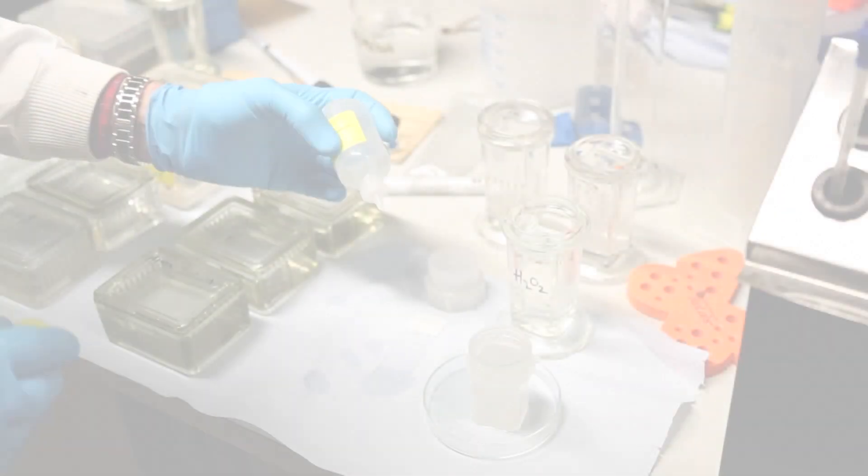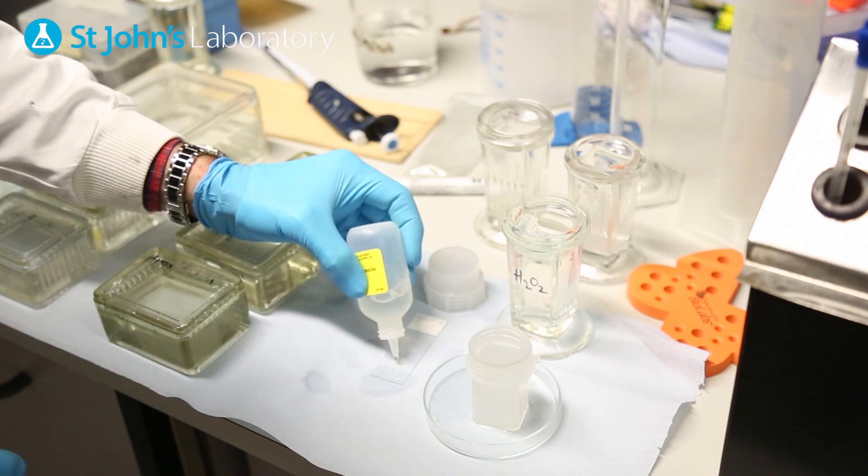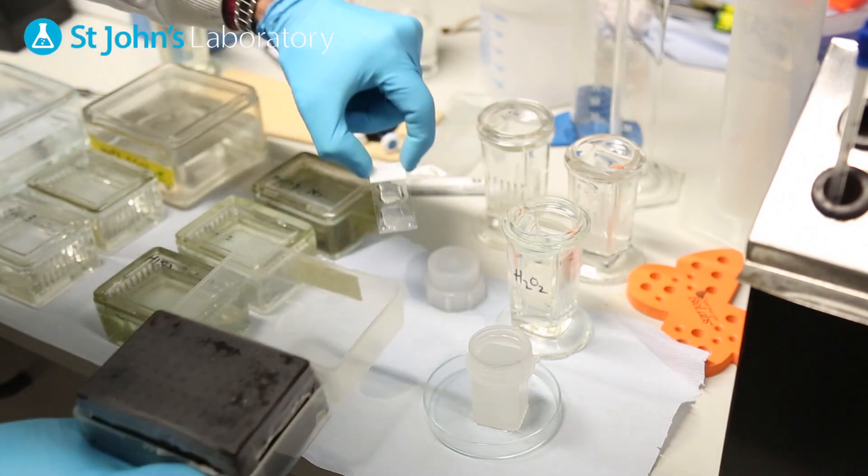To block the tissue background, use a PBS solution containing 10% BSA and place on a rocker in a humidified chamber for one hour.